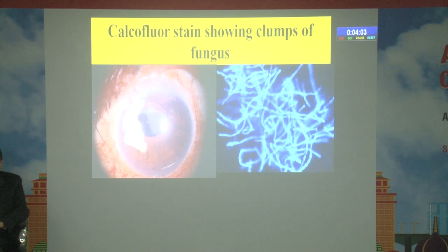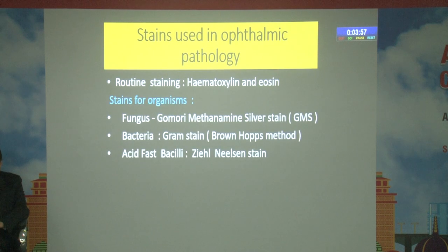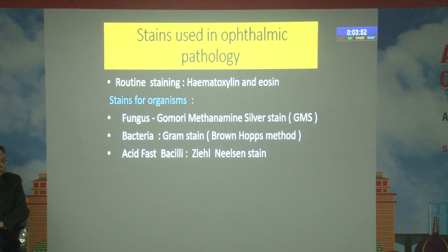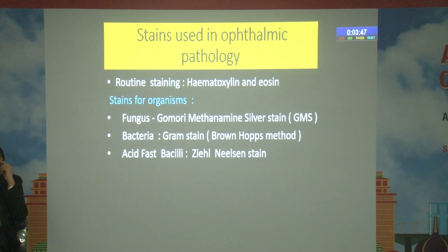This is a calcofluor stain showing clumps of fungus — you can see the fungus ball. Stains used in ophthalmic pathology include the routine hematoxylin and eosin stain, stains for organisms such as fungus using Gomori methenamine silver stain. For bacteria we use Gram stain and Brown-Hopps method. For acid-fast bacilli, we use the Ziehl-Neelsen stain.